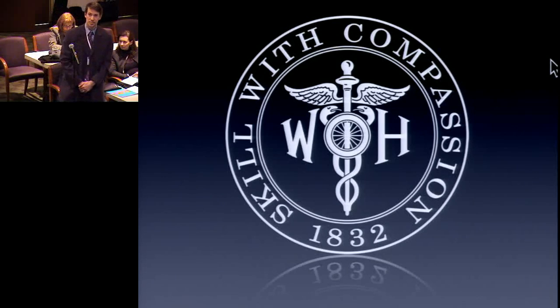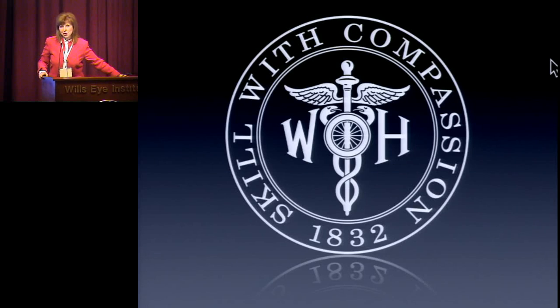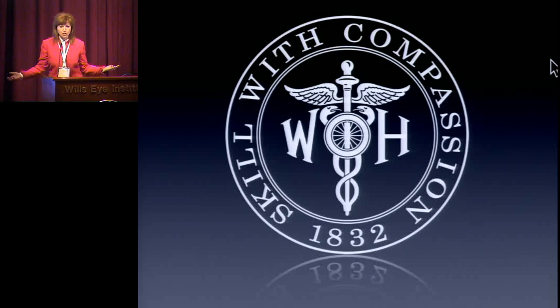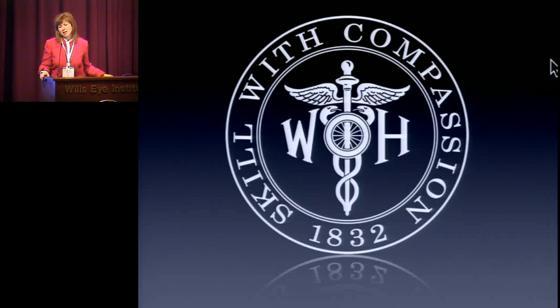But Michael, when you draw your optic nerves, do you find that if you're having a good day, the cup looks pretty small, and if you had a fight with your wife, the cup is quite big? And then when you sometimes compare, I remember in our old charts before we went to the computer, we had these thick charts, and I'd look at our drawings of the optic nerve, and sometimes they're small, and then they got big, and then they got small again. So what do you think about that? I don't think it's necessarily the best way to follow the disc.